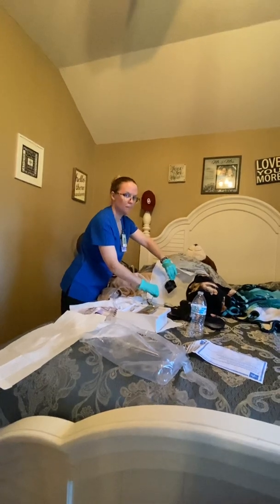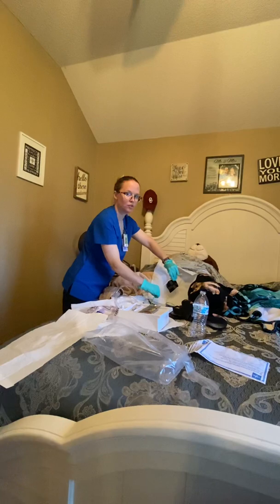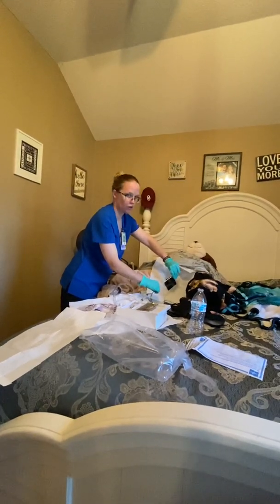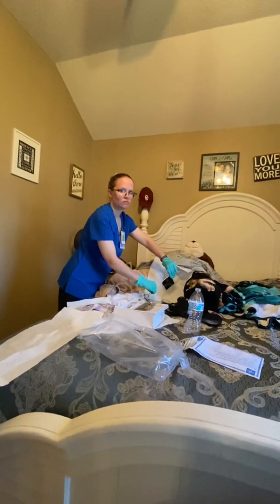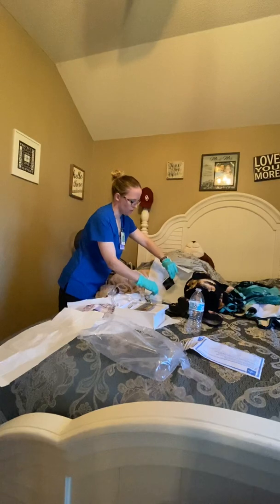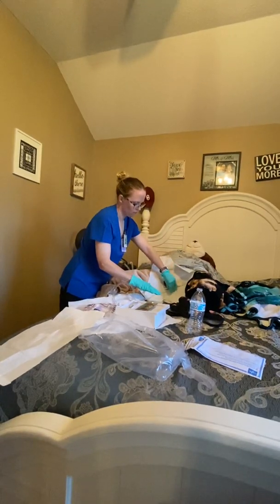And once you know that it's in there, then you just push it up just a tad bit more. And that's all there is to putting it in. So we're going to act like it's already in there. And now we're done with inserting.